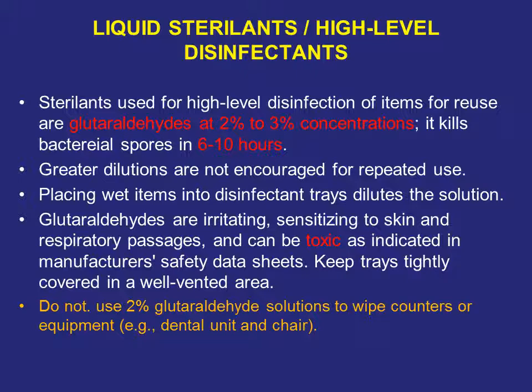Glutaraldehyde is a toxic material. It may cause irritation and sensitivity to the skin and respiratory passages. It should be placed in a well-vented area. The 2% glutaraldehyde solution is not used to wipe the dental unit and chair.